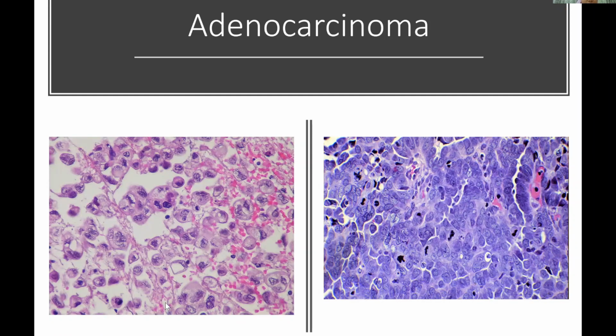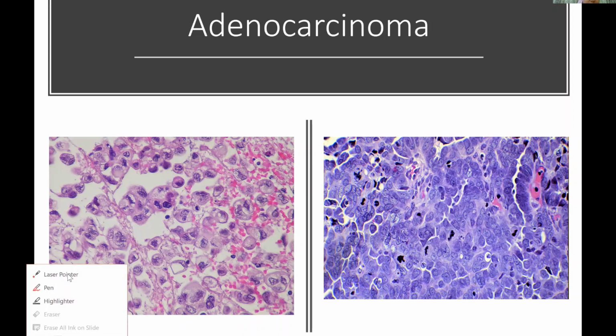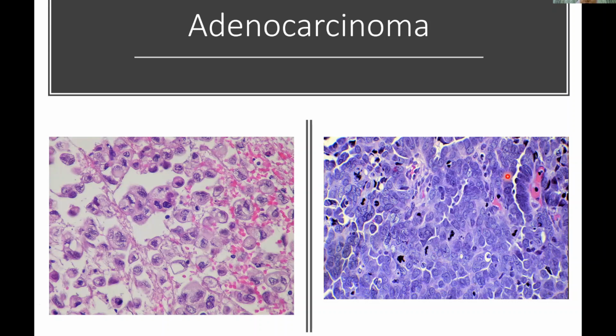Okay, these are tumor cells forming in sheets. There are very vague glandular structures, quite hard to tell. And these are tumor cells, individual and in clusters. They don't form any structures, and don't show any squamous differentiation. We can't see any keratin pearls or individual keratinization. So the most we can say is poorly differentiated carcinoma.